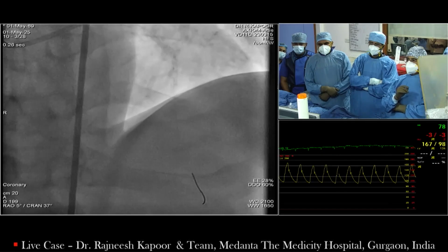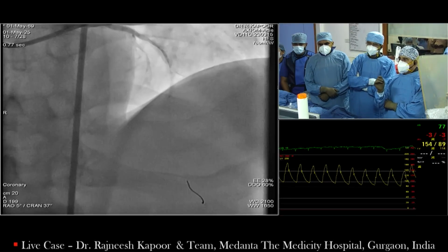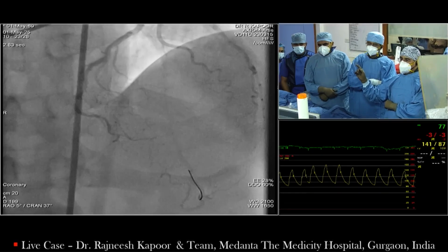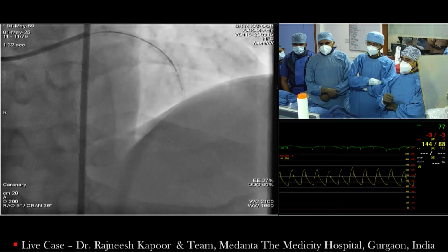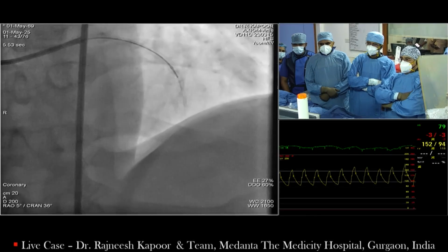So after this we took our orbital and parked it in the proximal LAD next, and tried multiple times. A question for you, Peter. A question for the panel.